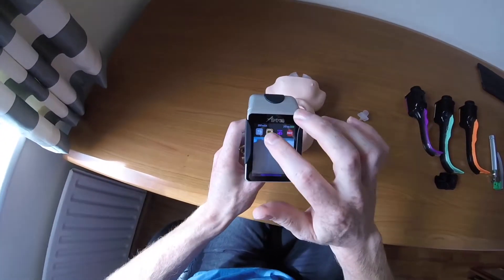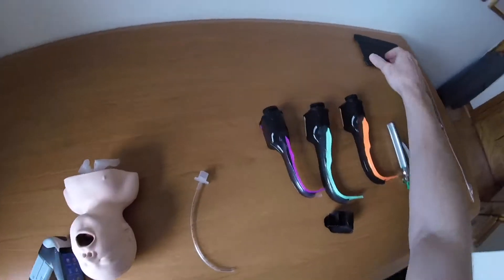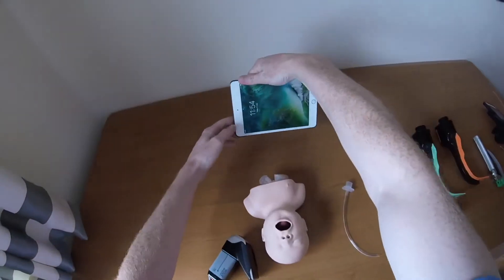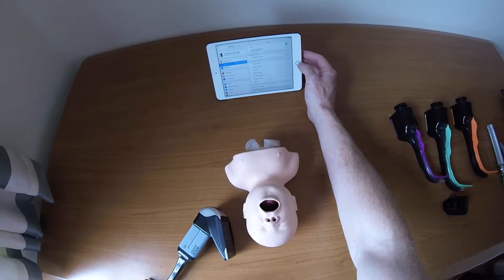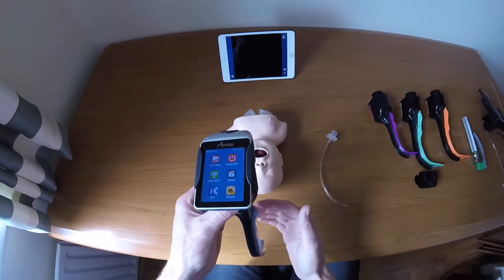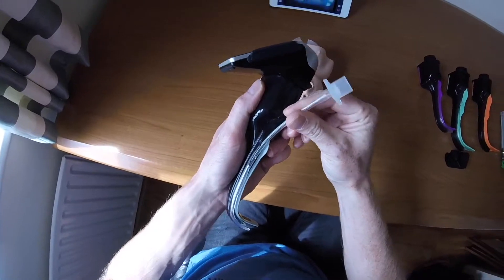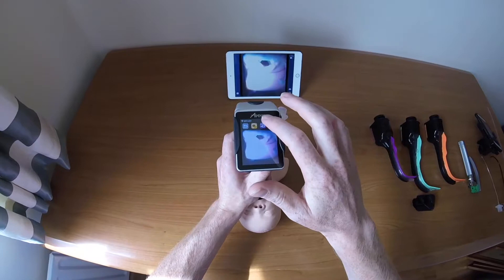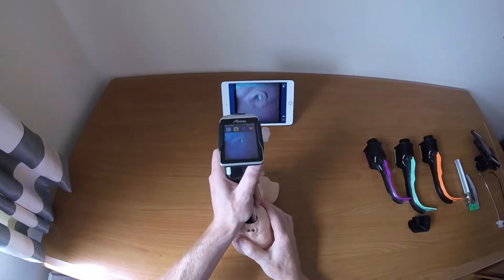You can also mirror the screen using wifi. Turn the wifi on, select the Airtrack wifi network, then go back to the Airtrack app. In the live view the camera feed is mirrored onto the iPad. Make sure to activate paediatric mode — without it the screen will be very bright — pressing it brings it back to a good viewing level.